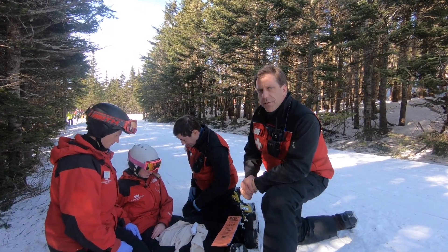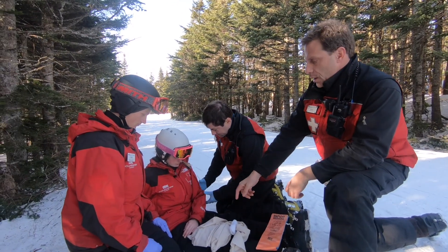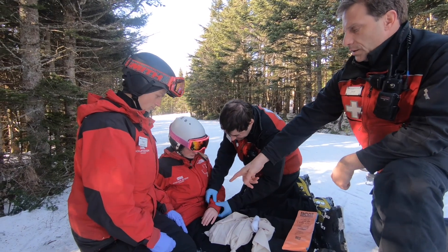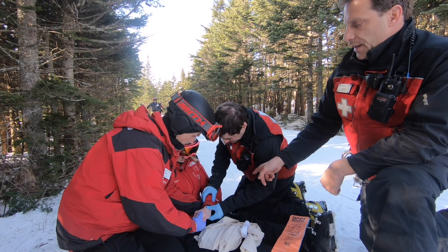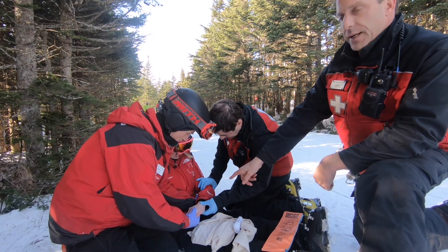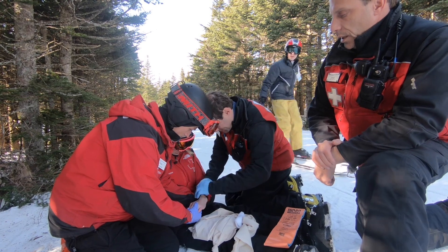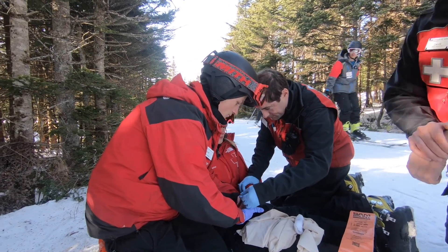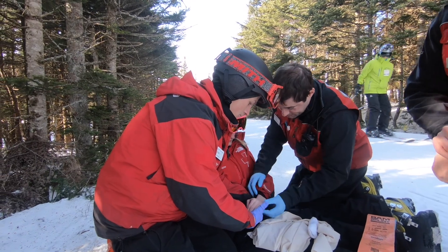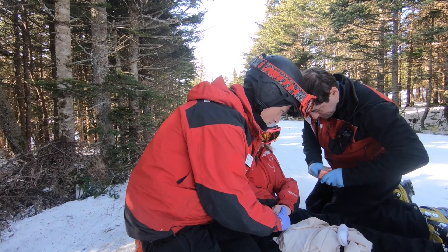We're going to have Sally simulate a fractured wrist. Chad's going to hold stabilization. Matt's going to examine the area — he wants to make sure that he has good pulses and good capillary refill. Now he's going to take the SAM splint and apply it as our immobilization device.